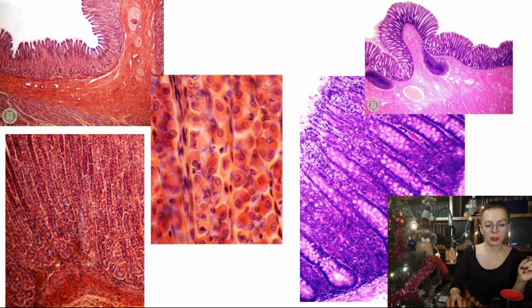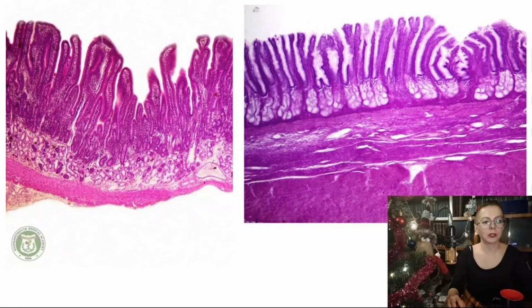They prevail. While in the colon, inside crypts, empty mucous cells predominate. So empty cells versus red cells. This is the most distinctive feature, and if you want to be sure, look at cells inside crypts and glands. Of course, they look like each other. You see both of them are tubular, glands and crypts, tubular, and they are oriented parallel. But if you look at the cell, you can make the difference.